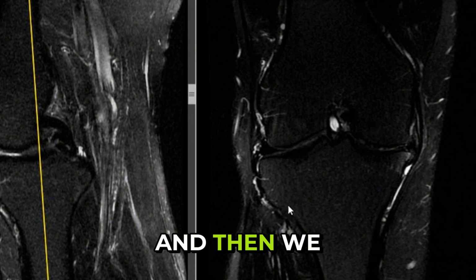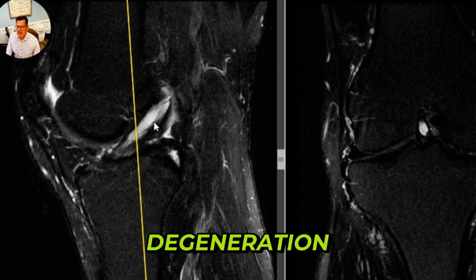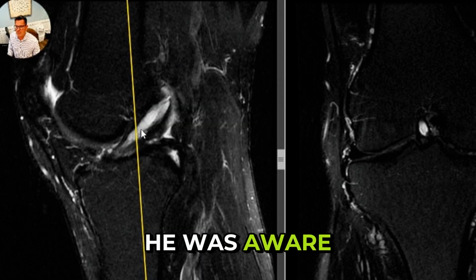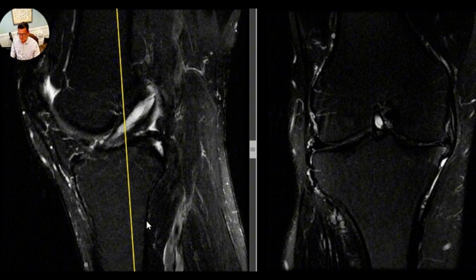And then we also saw his ACL had some mucoid degeneration, no real instability, no tears as far as he was aware, and a negative anterior drawer. But I told him I wanted to treat that with an injection of PRP.